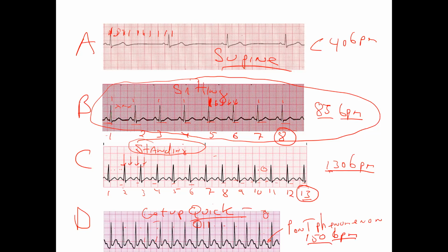Now her heart rate's going to drop back to the normal standing. It should drop to this very quickly. And the more she stands and relaxes, it should go down. So this is the resting heart rate that I would use for her baseline if I had to write it in a chart, because it's sitting with her feet on the floor.